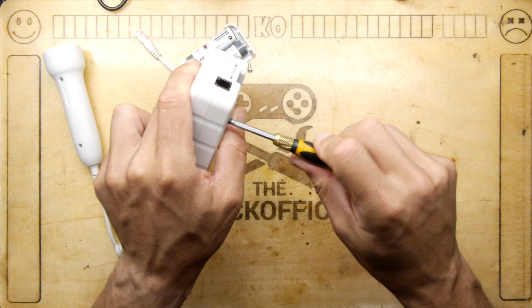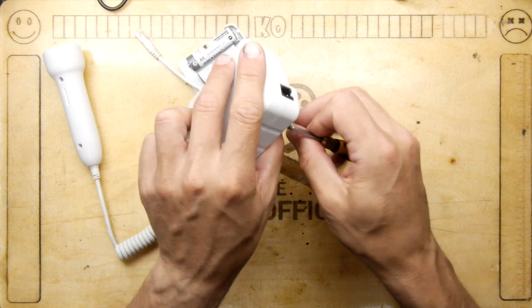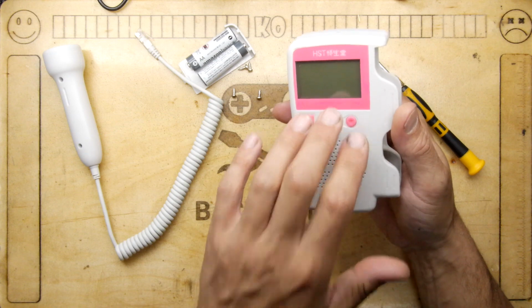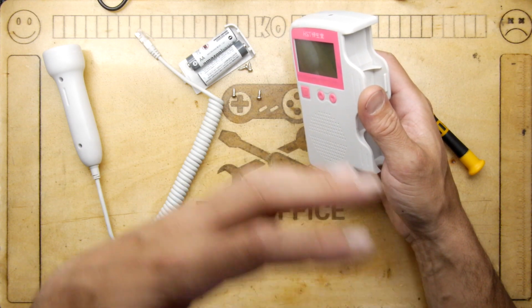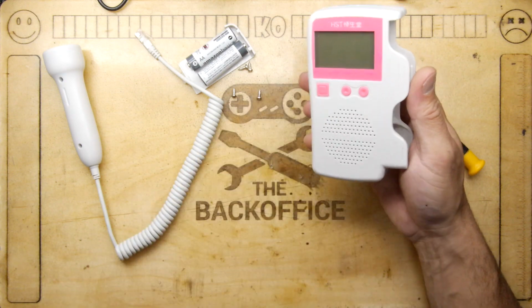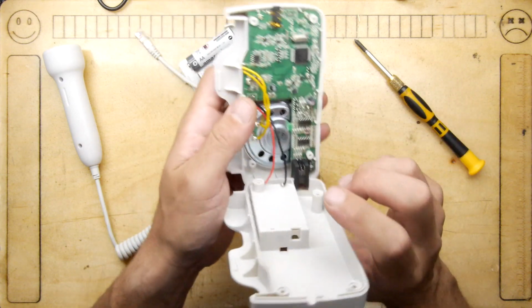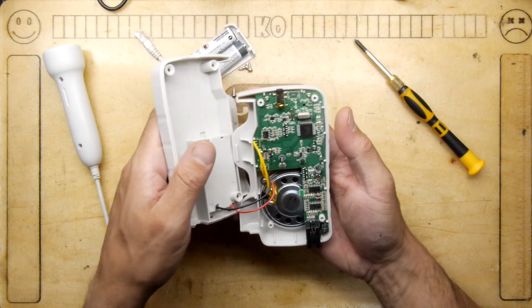So it's quite interesting. But I think there's a lot of processing on there. And what you hear initially is, I think that's why it starts off quiet and gets louder and louder. It's almost like the system dials into the frequency of the pulse, like it hears it, and then it starts overlapping the playbacks or something like that to increase the amplitude. There's definitely something going on. It's not just like a sensitive microphone listening at your chest.